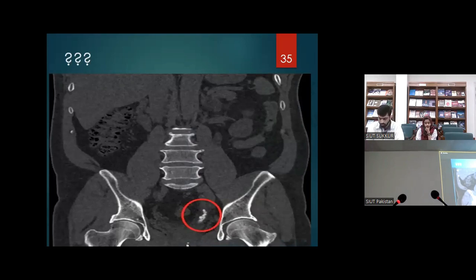This phenomenon of the infundibulopelvic angle, again, is very important. Earlier, 10 or 15 years back, or maybe more, when we were residents, it was a norm that if there is a stone in the lower pole, lower calyx, and it is not obstructing, there is no hydronephrosis, then it should be left behind. There is no problem, because if you break it, it will jump up and come down on its own. But now the bottom line is if there is a stone, it has to be cleared. There is no point in leaving behind a stone, maybe in a fragmented fashion, and saying that it is not causing obstruction, so just let it be there. If there is a stone, it has to be cleared in toto.